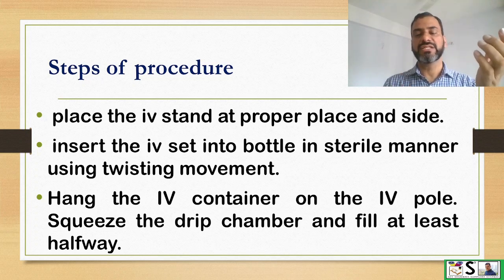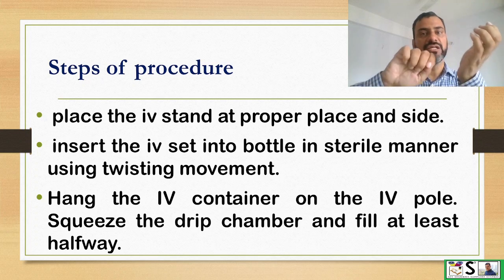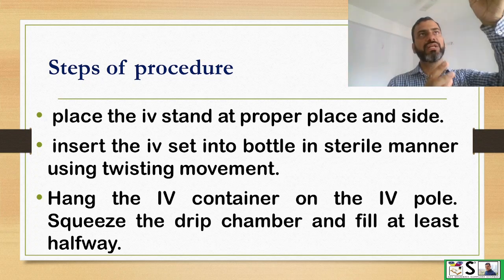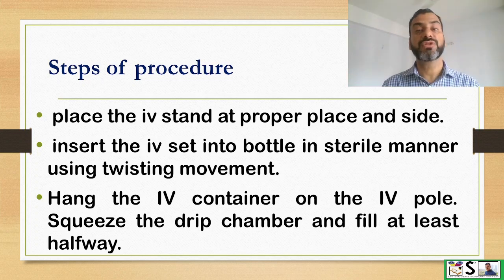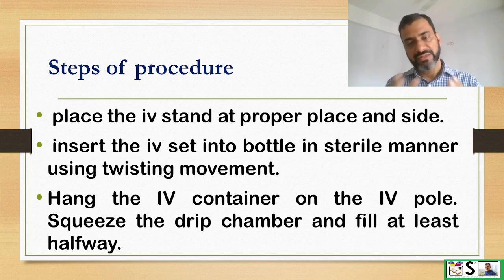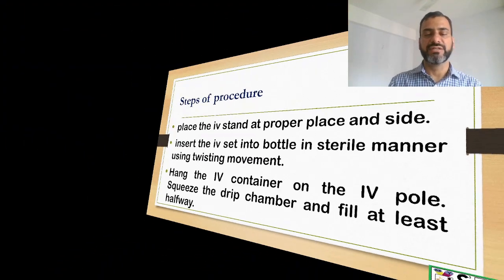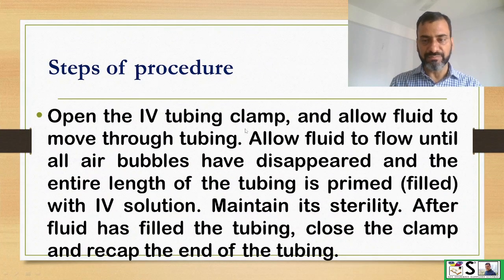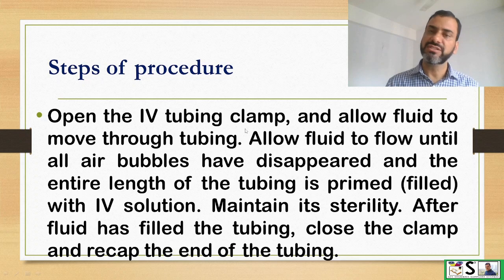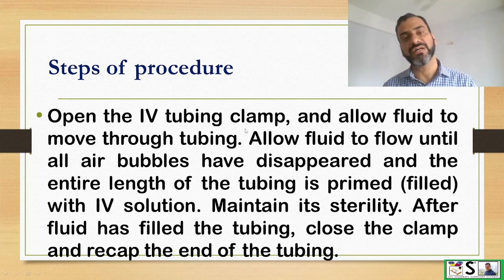Take the bottle — normally 500 ml bottles are used for IV infusion. Insert the IV drip set into the bottle in a twisting manner and then hang the bottle on the pole. Squeeze the drip chamber so that it is filled halfway, then open the clamp. Allow the fluid to run through the tube so that air is removed and the tube is filled with fluid. This is known as priming of the IV set.